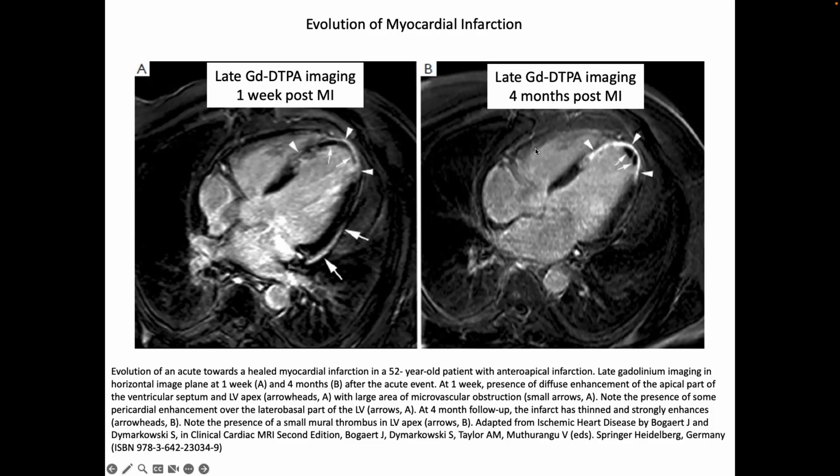And then if you come back to this patient 4 months later, you can see, oh, okay, all of this stuff was actually getting no blood flow. It is all now infarcted neatly. This stuff probably still isn't getting blood flow, right? So very detailed pictures of the state of a patient's heart post heart attack.